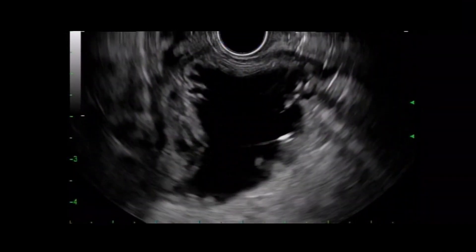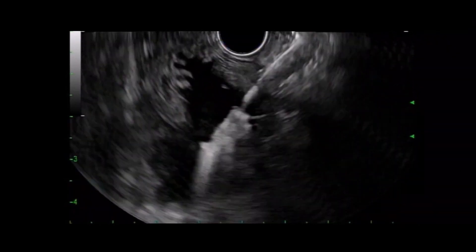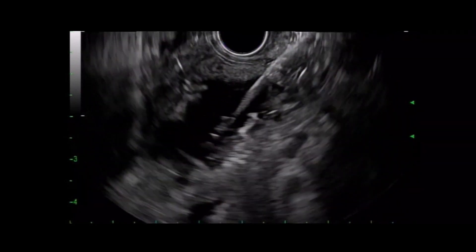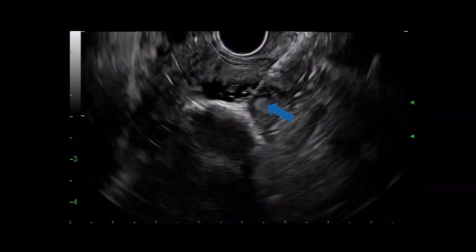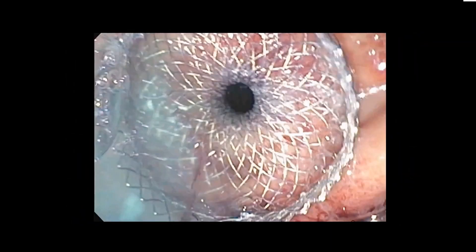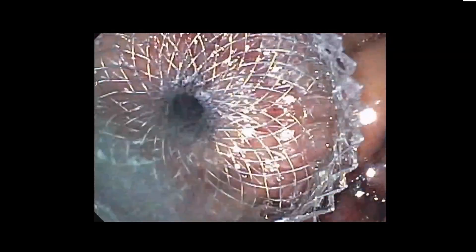Maintaining the same EUS view, direct placement of a 20-millimeter electrocautery-enhanced lumen-apposing metal stent (LAMS) was performed. The distal flange was deployed under EUS guidance. Following deployment of the proximal flange, bluish-colored fluid was seen draining from the stent, confirming appropriate stent position in the jejunum.